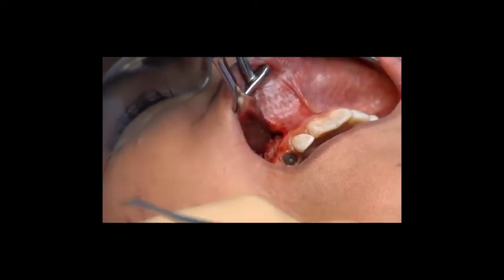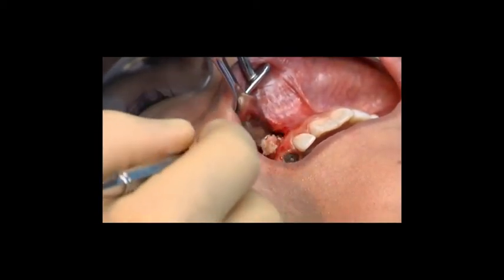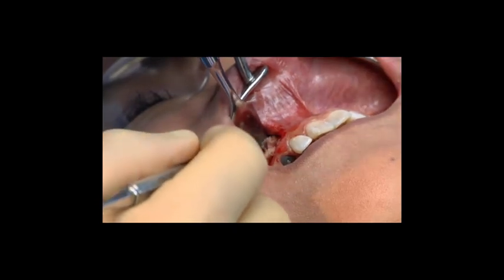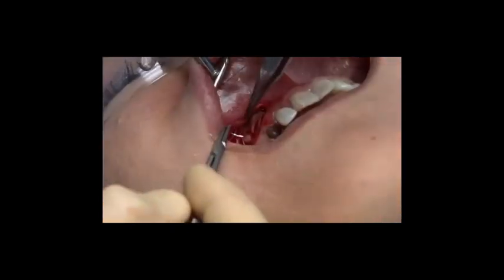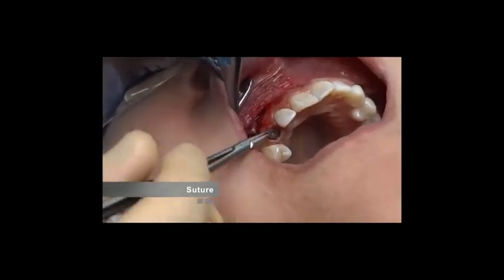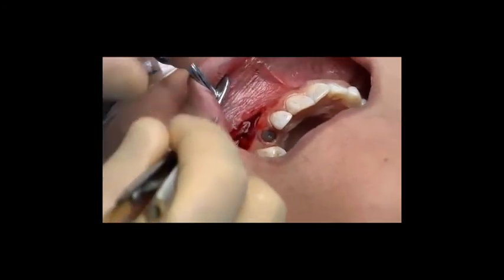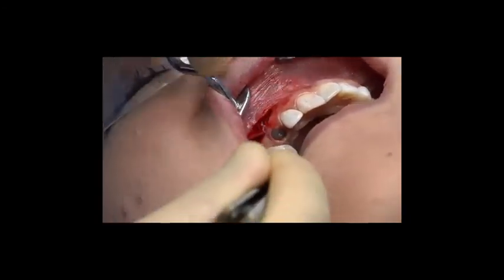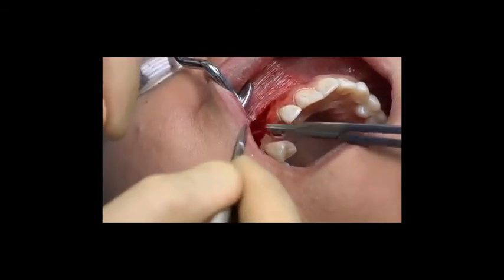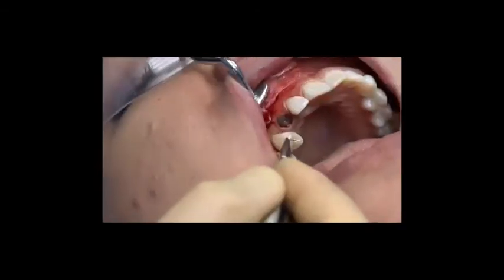The bone grafting is done in a layered technique. This is a corticocancellous allograft first, a mineralized demineralized blend. I typically like to use a product from Maxius, which is a mineralized demineralized blend. Other companies have this product too, but I like the Maxius bone, and this is then applied as a first layer. The second layer is then a xenograft, typically BioOss, and then a resorbable membrane on top of that, such as a pericardium membrane, and then a PRF membrane over that. So those are the layers apically, and then here the suturing.